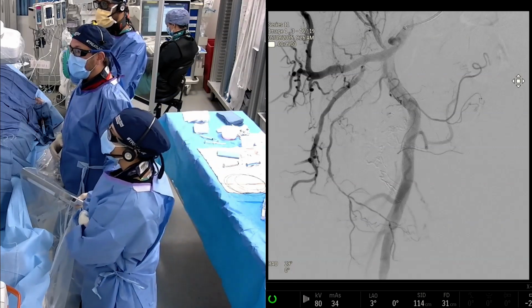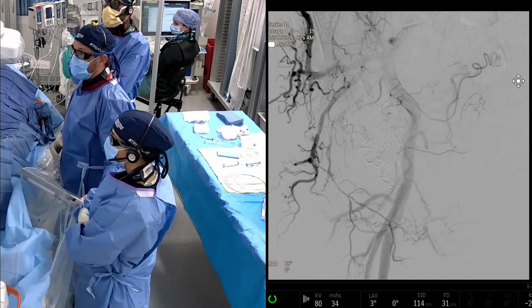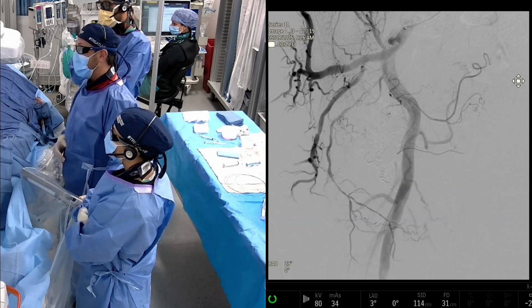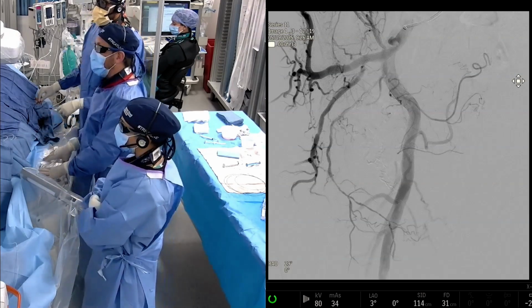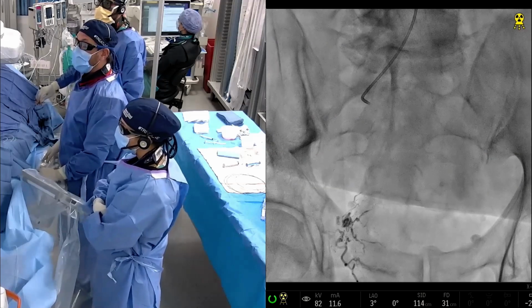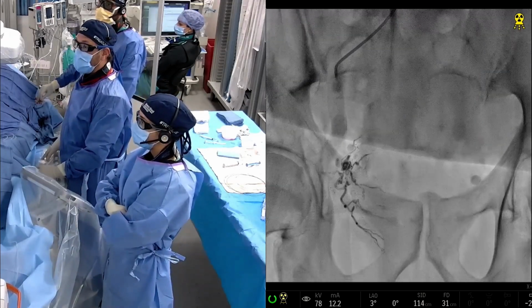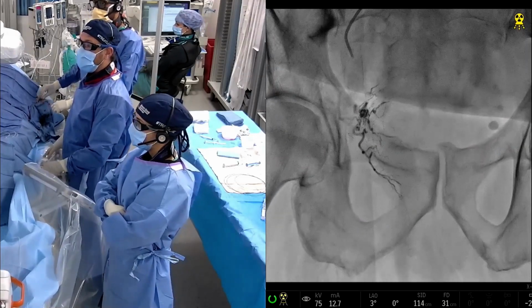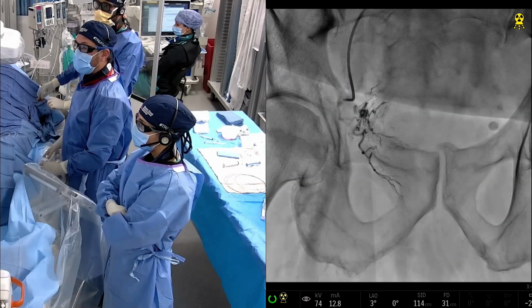We're also missing the obturator, which we know is replaced, and you can sort of see it as we scroll through this angio. You can see it off the external. So we could take a look and see if there's any alternative feeders, because we don't have a CTA. So we may want to do that before we go to the other side. We'll just hit that external real quick. So we're going to pull that catheter back a little bit and then just puff it down with a little bit of contrast. We can even just do the run almost right here, actually. That's probably fine. See if you can drop the catheter into the artery itself. So right now we're in the external, you can see, and then we're going to ultimately find that obturator off of the inferior epigastric. Might be a little bit higher.